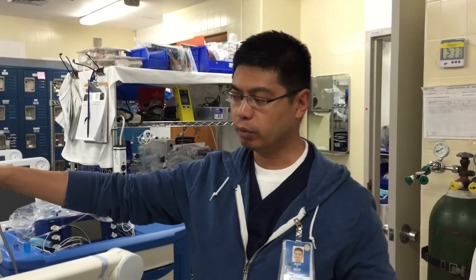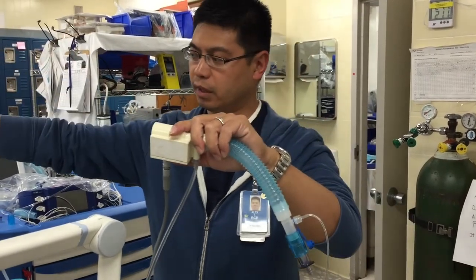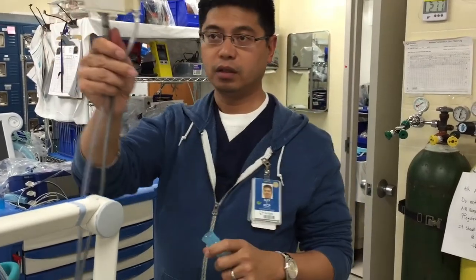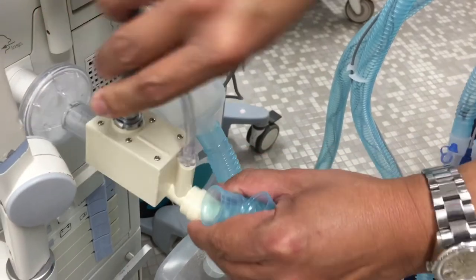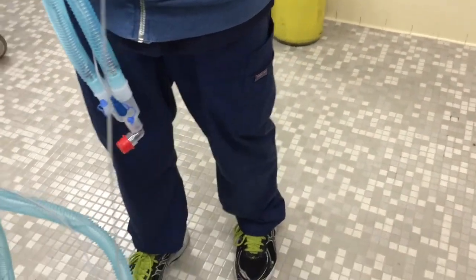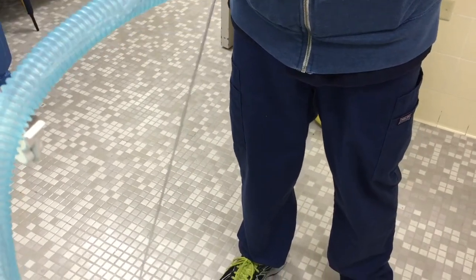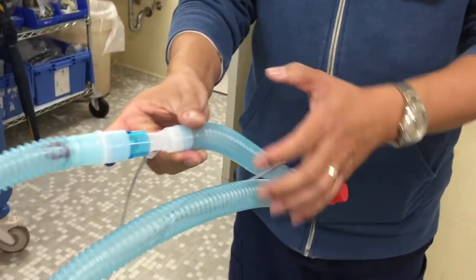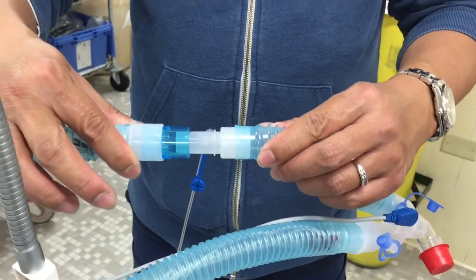Now we're going to show you how the iNO Max interfaces with a patient that's on a ventilator. First, take your whole setup, disconnect that and disconnect this — your injector module will connect after the filter, like this. Then take off that little nipple and connect on the inspiratory side of the ventilator, like that. This part is a little bit loose, so what you want to do is just tape around this connector and you should be good to go. And that's how the iNO Max interfaces on a patient that's on a ventilator.